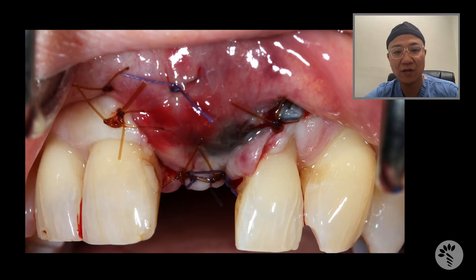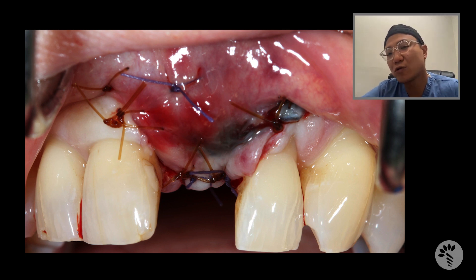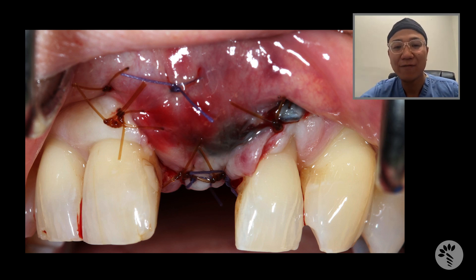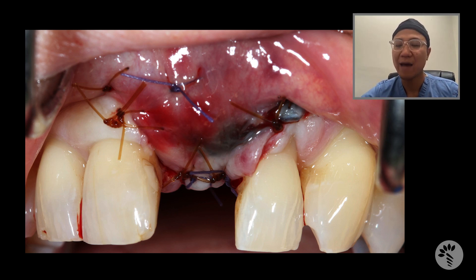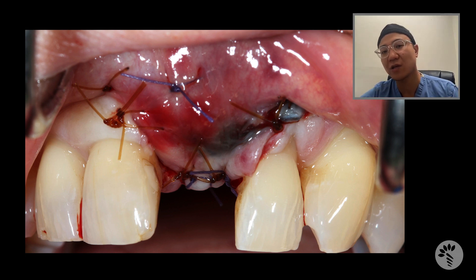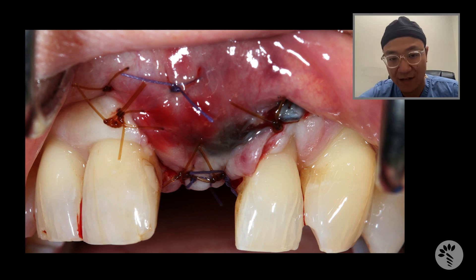This is the frontal view. One may say, hey, you just altered the mucogingival junction. Yes, I did. However, I would rather get good bone and adjust the mucogingival junction, because as a periodontist and experienced surgeon, I can always re-correct this predictably using the principles of soft tissue grafting.